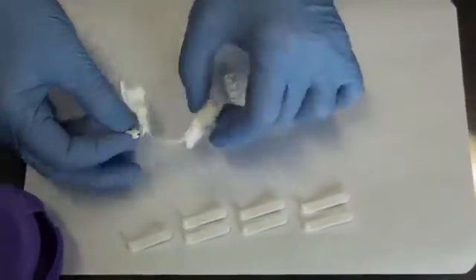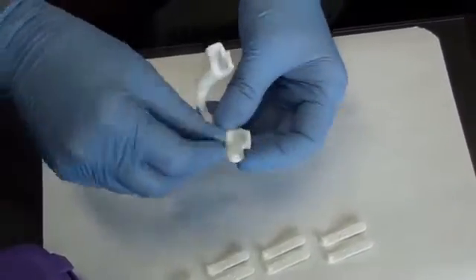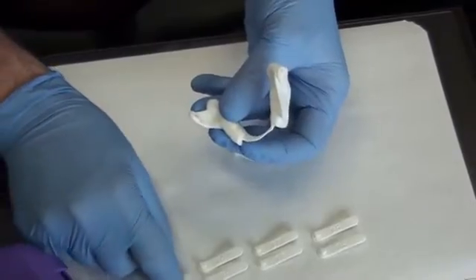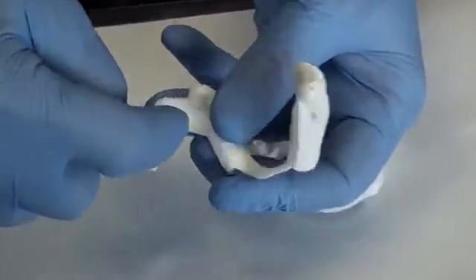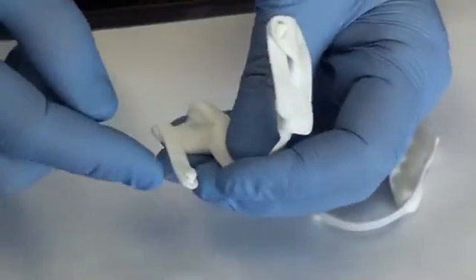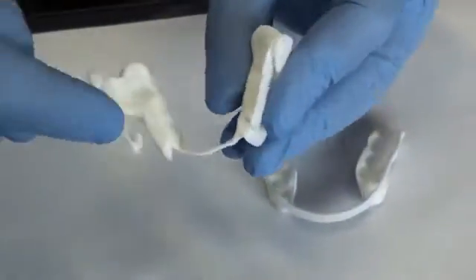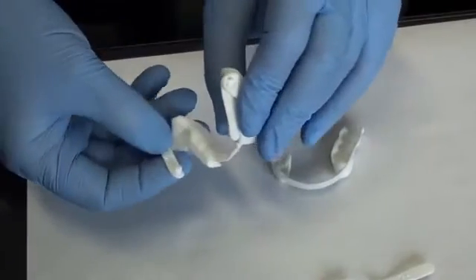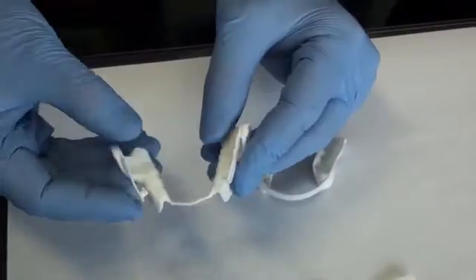We take the 25 mm rod and insert it in the lower part of the device, the one with triangles. On each side, the numbers must be placed inward to avoid friction at the cheek level. If the numbers were placed outward, it would not cause much discomfort, but it is better to place them inward.